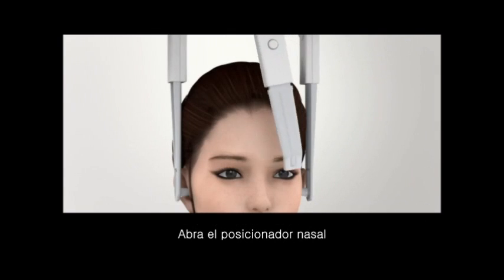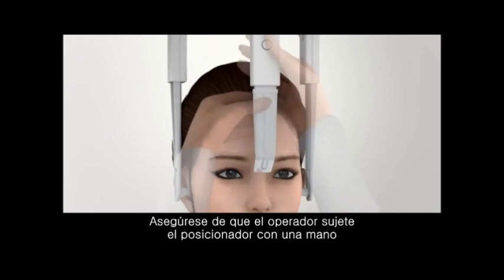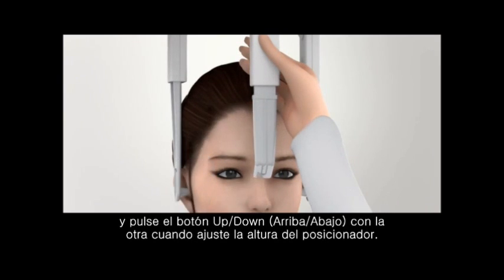Unfold the nasal positioner down and set the nasal positioner at the root of nose between the eyes. Make sure operator keeps holding the positioner in one hand and presses the up-down button in another hand when operator adjusts height of the positioner.